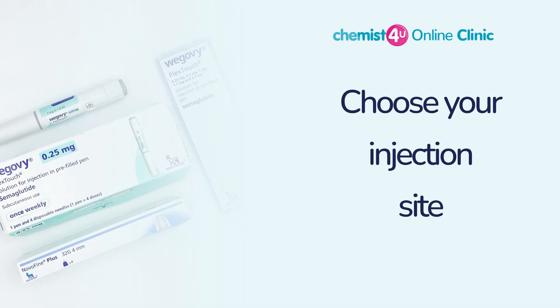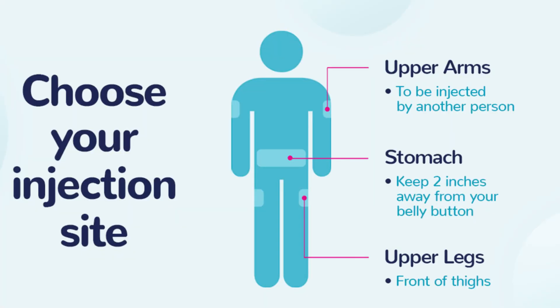You can inject Wegovy in your upper arm, stomach, or thigh. If you inject in your stomach, keep it two inches away from your belly button. You can inject in the same part of your body each week, but make sure it is not the exact same spot each time. Don't inject in an area where the skin is tender, bruised, red, warm, or hard, or areas with scars or stretch marks.